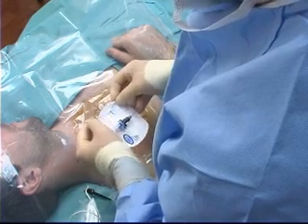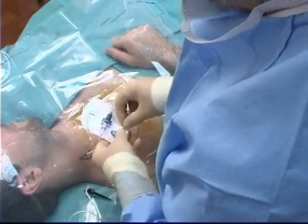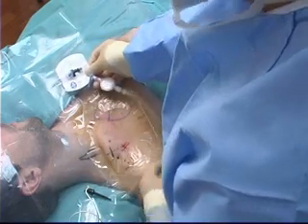The snap lock and catheter are attached to the stat lock, which is attached to a convenient place on the opposite side of the upper body.